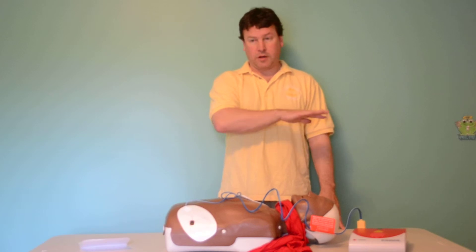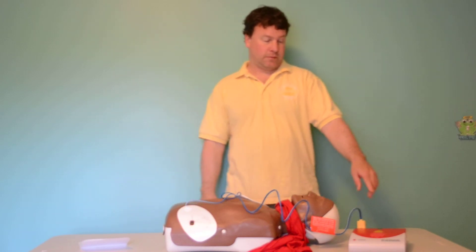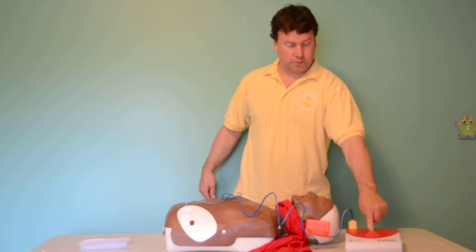Charging. Everyone stand clear. Push the shock button. Everyone clear. Shock delivered.